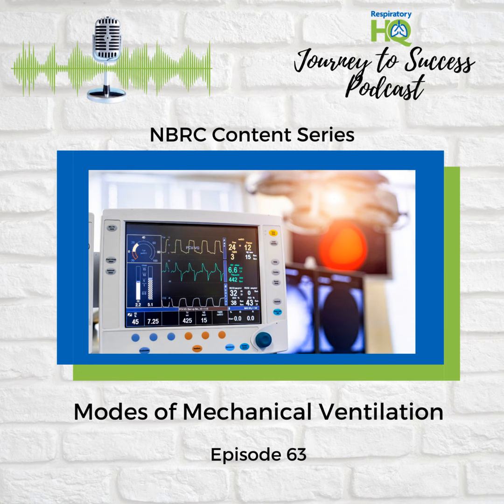I like that. And because it works in tandem with the patient's efforts, PSV is often used to help facilitate weaning from the ventilator. Weaning keeps coming up. It really does seem like the ultimate goal for most patients on mechanical ventilation. It is. We want to get them back to breathing on their own as soon as it's safe to do so. And PSV can be a valuable tool in that process. It reduces the work of breathing, which can be especially important for patients who have an artificial airway in place.